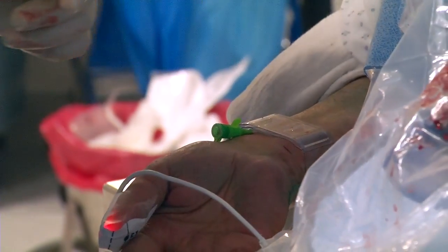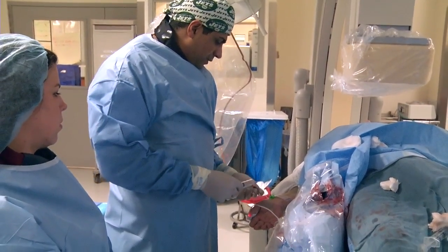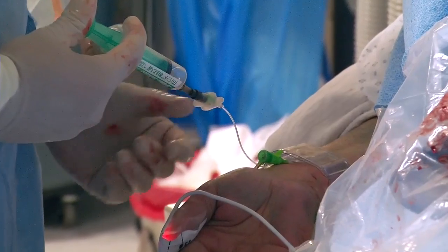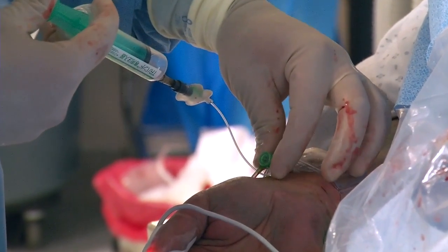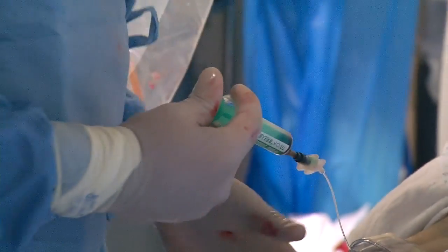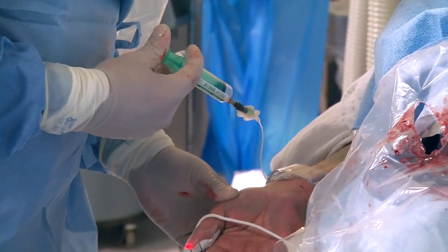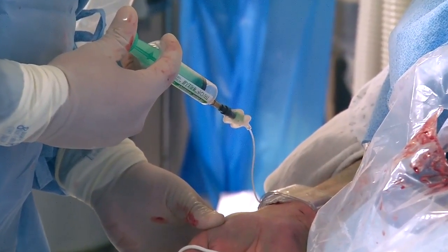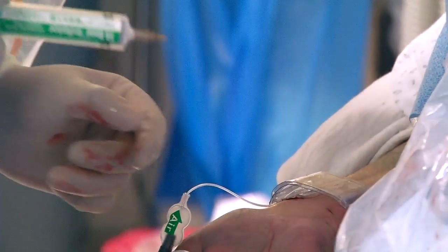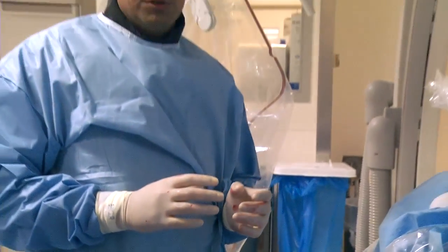Now we're going to pull back about 15 cc's of air, and we're going to inject that. And as we're putting the rest in, we're going to pull the sheath back. So now we have about 15 cc's of air in, and now we're going to pull back slowly until we see a flash of blood. Okay, I see a little flash. I'm going to add 1 to 2 more for a total of 12 cc's of air. The reason that we've done that is that we have patent hemostasis.